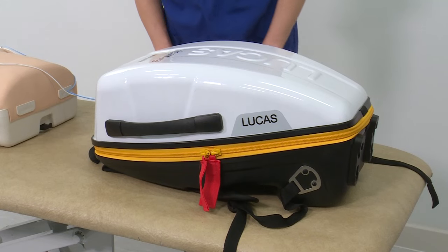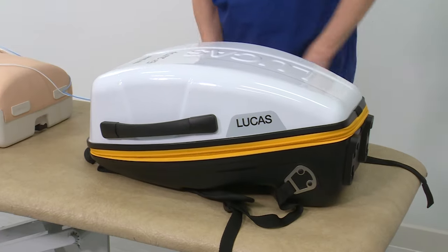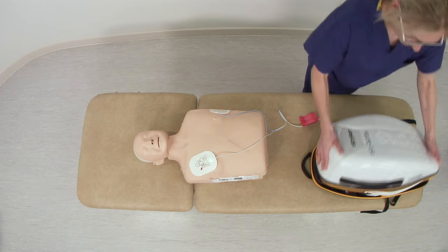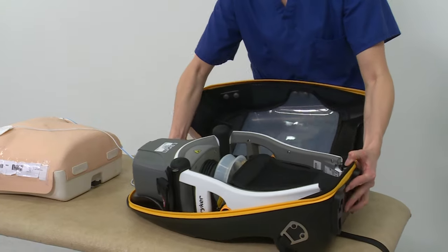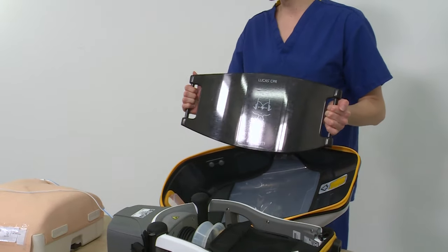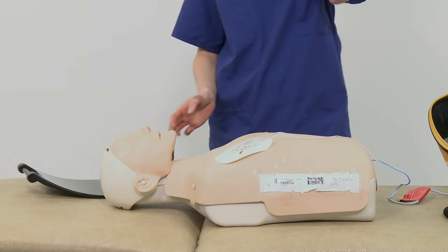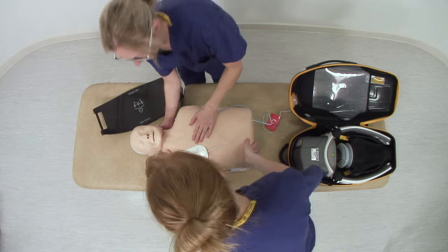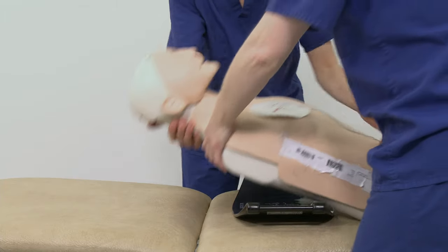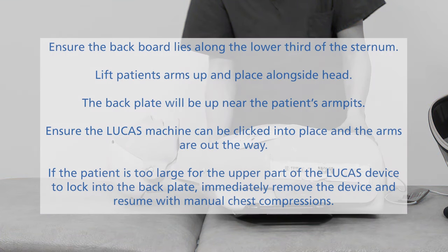To remove the Lucas from the box, unzip the box and remove the backboard from the lid section. To correctly place the backboard, lift the patient forward with two staff or roll to the side. Slide the backboard under the patient and lay the patient down.